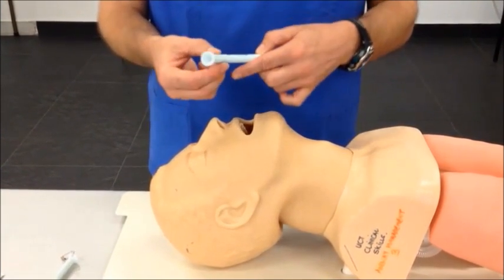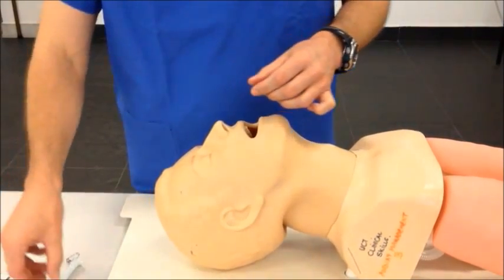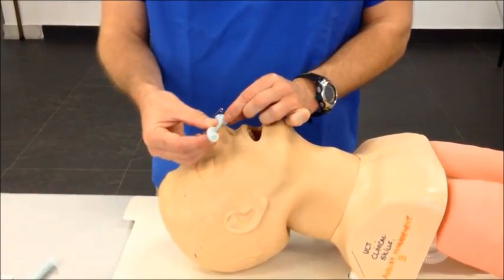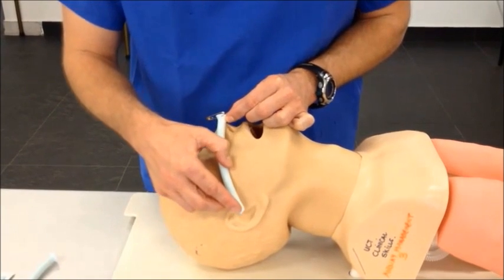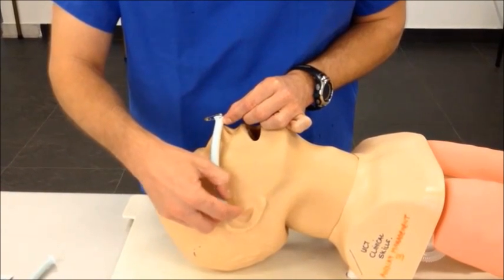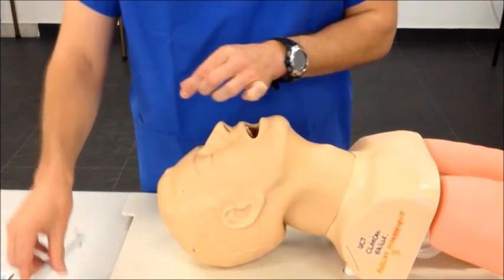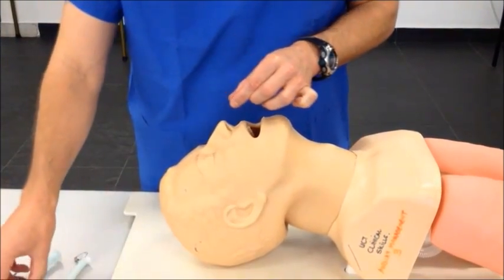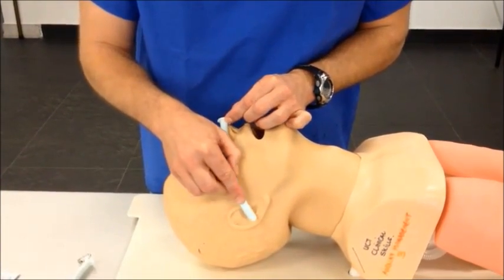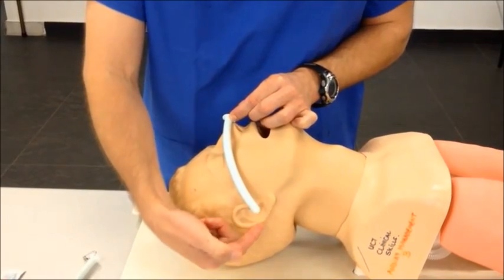When selecting the length of the nasopharyngeal tube, lay the flange of the tube at the tip of the nose and then across the face to the ear. The tip of the nasopharyngeal airway should end at the tragus of the ear. This nasopharyngeal airway is clearly too large as it lays beyond the ear.